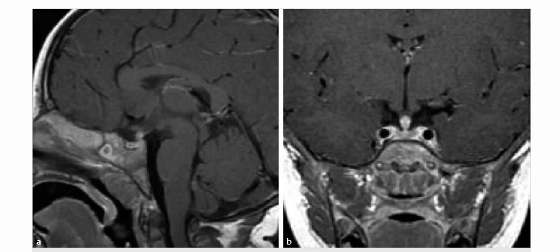These are images of a nine-year-old girl presenting with stunted growth. On the sagittal and coronal post-contrast T1-weighted images, we can see abnormal enlargement and enhancement of the pituitary infundibulum.